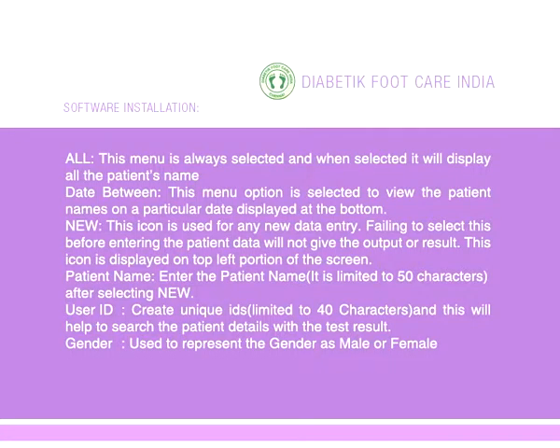New. This icon is used for any new data entry. Failing to select this before entering the patient data will not give the output or result. This icon is displayed on the top left portion of the screen.